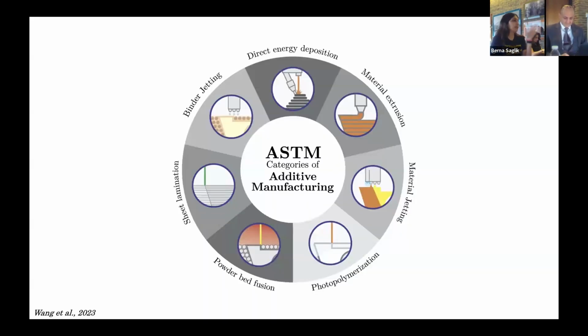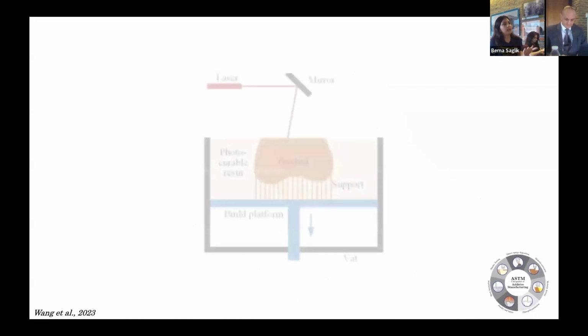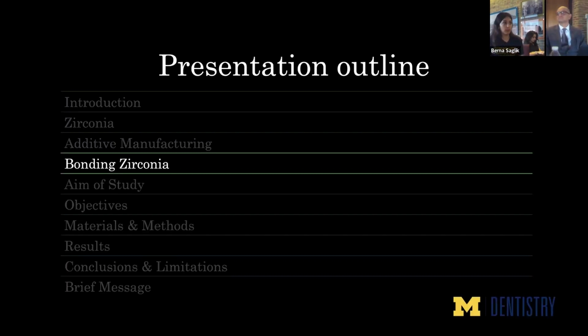As I said, there are multiple additive manufacturing techniques. For us in specific, just because we use that in our project, we're going to talk about the SLA, and I think they've already covered that for us. It's basically having that build platform descending downwards each layer. So you have the resin covering, the lasers solidifying whatever that STL file has, and then the platform descends downwards, exposing a new layer, and that would be solidified as well.